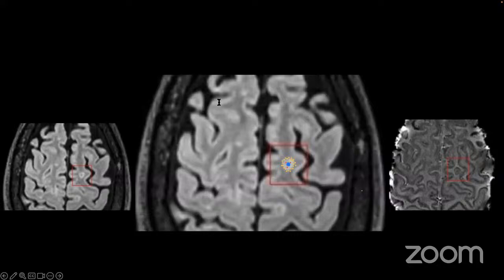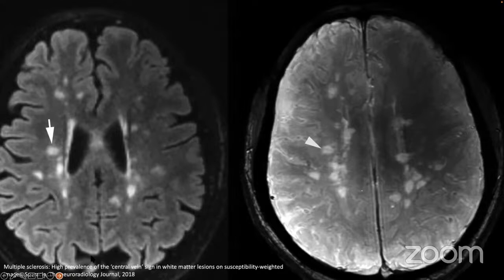So Dr. Yasser is asking about the lines, the Virchow-Robin lines or central vein lines, if they are not matching exactly these lines. If most of the lesions are not matching this line, it is likely not MS. If most lesions follow this pattern, follow the linear pattern, then you make a conclusion that this is MS. And actually, it can be helpful in challenging cases with multiple white matter hyperintensities. And here's another example of the central vein sign. On the right hand side, you will see a gradient echo.